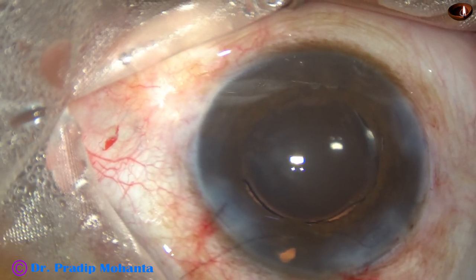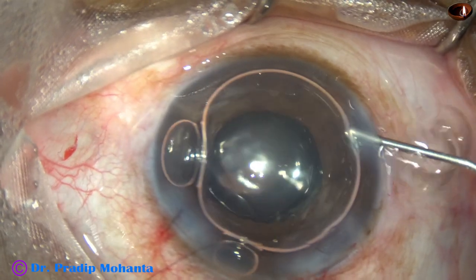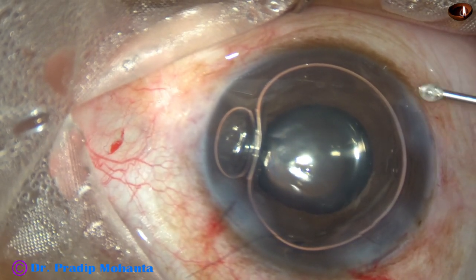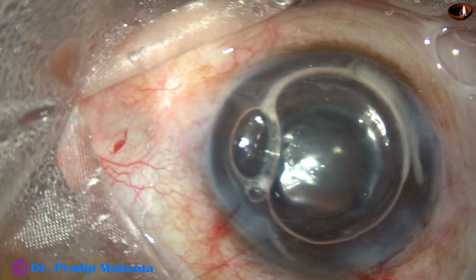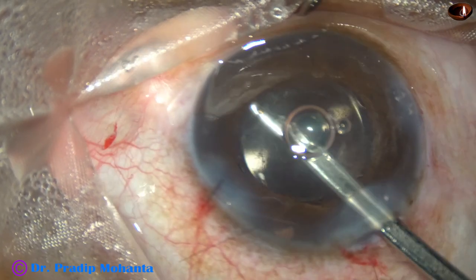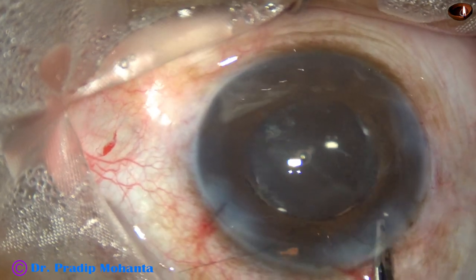This iridectomy is not necessary if we could place a standard three-piece intraocular lens, but it is better to do an iridectomy if we place a hydrophilic lens in the sulcus. Now I inject triamcinolone and find that there are vitreous strands at 2 o'clock and 8 o'clock, so I have to take care of these vitreous strands.